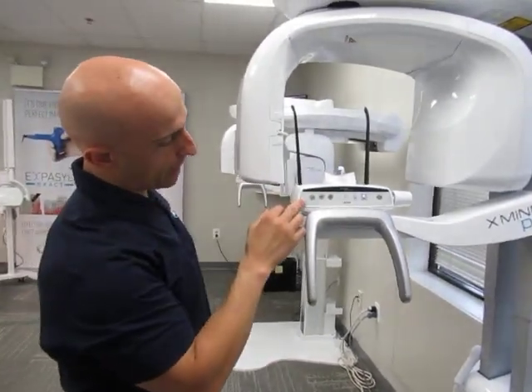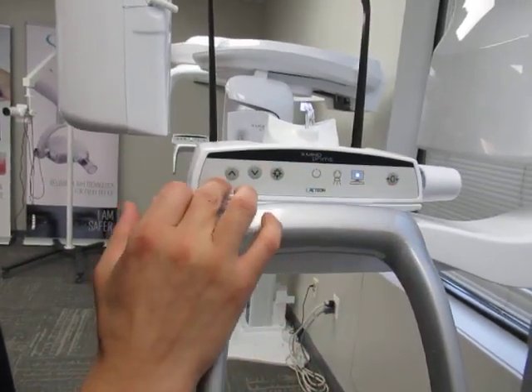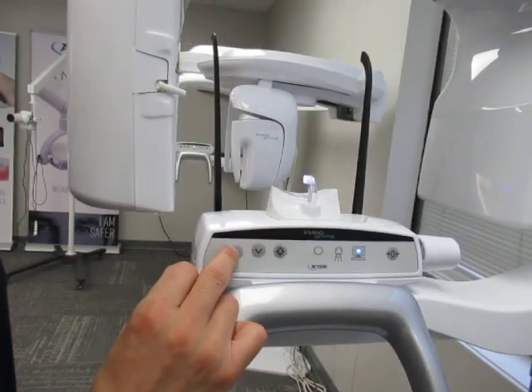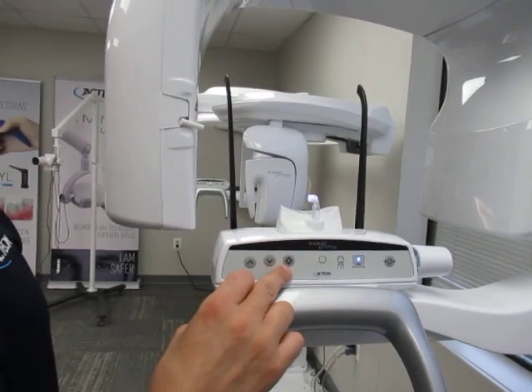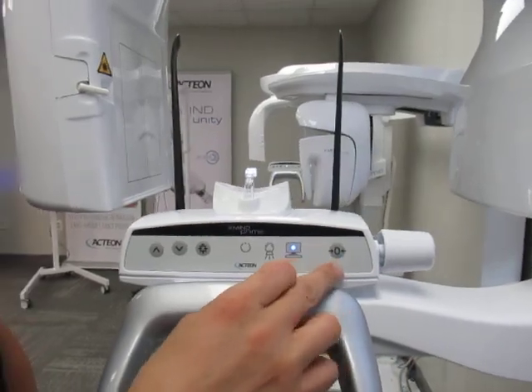Right here you have your control panel — it's very basic. There are four buttons, up and down, to adjust the height of what we call the column, according to the patient's height. Next to that there's a laser button, which looks like a light bulb. On the far right is your reset button, where the zero is.